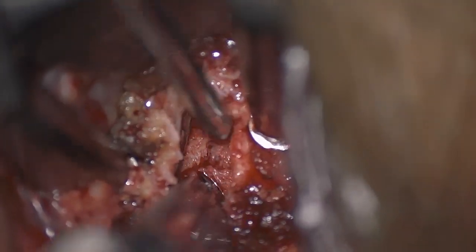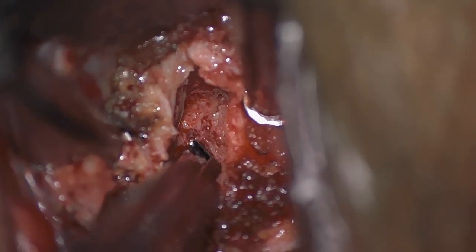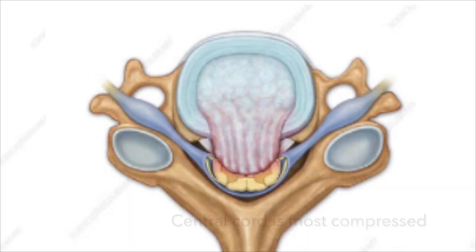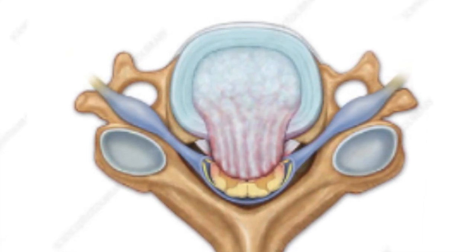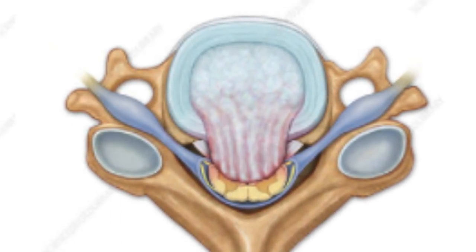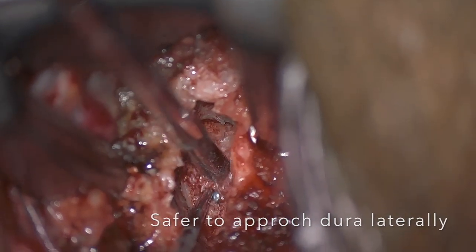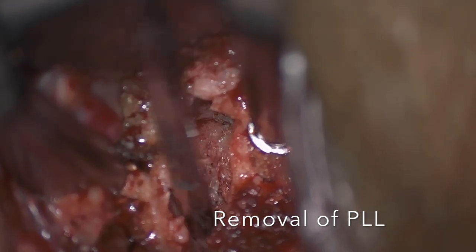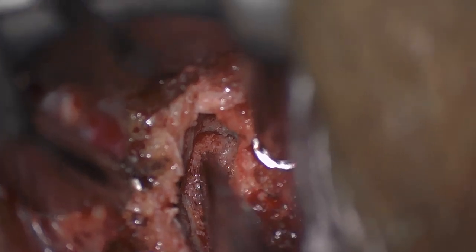Once the osteophytes have been completely thinned out, a 1 mm rongeur can be used to safely remove the remaining osteophyte. It is important to completely remove the inferior osteophyte, as the superior osteophyte will come out as part of the corpectomy. Most of these cases will have central compression, and the PLL is thickest at the center, so it is safe to approach the PLL laterally. A ballpoint probe is placed between the PLL and the dura, the PLL is lifted up, and a number 11 blade is used to cut the PLL safely.